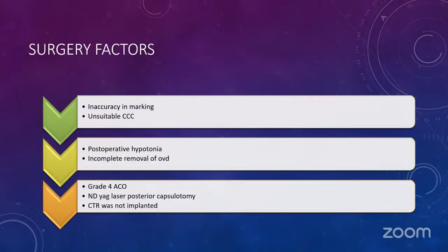For example, Callisto and Verion both use the limbal vessel anatomy and location as reference points. However, if the patient has some chemosis or some bleeding, then there is a chance that the digital system might also make some mistake. So you should always have a backup plan of manual methods ready. Unsuitable CCC: if the IOL optic size regularly used is 6 mm, the CCC should be 5.5 mm. The capsule should cover 0.5 mm all around the optic so that there is less chance of rotation.